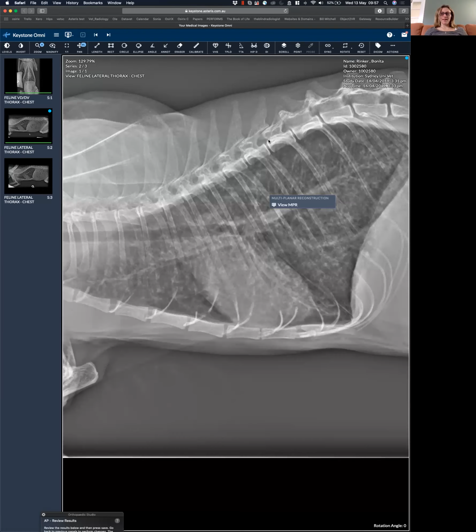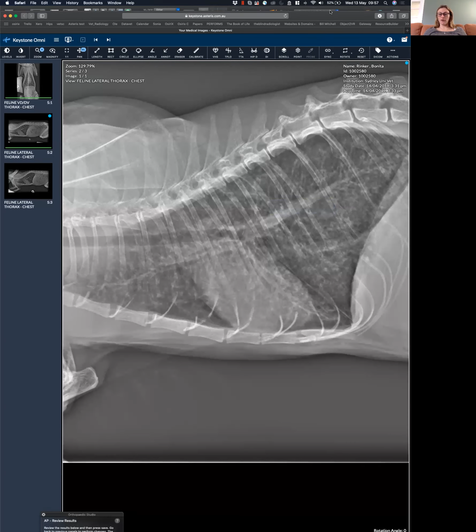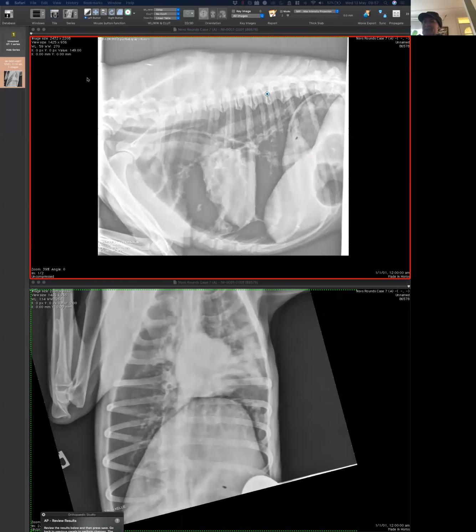Sounds good. Thanks, Mariano. For anybody interested, Kelly, the dog that was in the radiographs today, was in hospital for 3 days with management of aspiration pneumonia. The initial pneumothorax never recurred, and she made a full recovery and went home fighting fit. Oh, thank you. Can you get a liter out of a dog's lung, if there is no actual pneumothorax? Probably not, because normally you'd collapse the lung, but you could certainly cause an iatrogenic pneumothorax and then drain that in the process of doing a tap. So I don't know where that air came from. I think you'd be really lucky to get into an airway big enough to give you a litre of air on one side, let alone both. I think she clinically improved a lot as well after they drained 2 litres of air off. Her oxygenation was much improved.